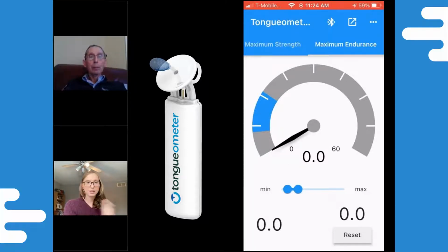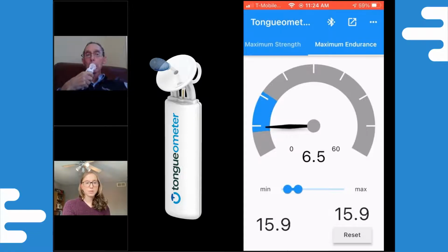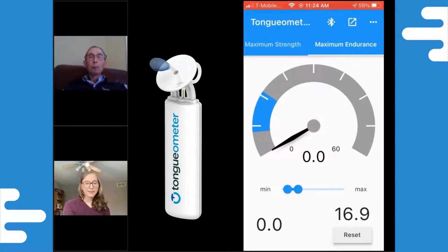So Ed has set the highlighted range here, and now I'm going to instruct him to hold the pressure in that highlighted range for as long as he can. So as soon as it gets into that highlighted range, the timer starts counting. Underneath the meter, it shows how much pressure he's applying. So right now, right around 7 kilopascals, and he's held it for at least 12 seconds. If it dips underneath that blue range, the timer stops. If it goes over the blue highlighted range, the timer continues. So here for this exercise, you can see that Ed's maximum endurance is 16.9 seconds.